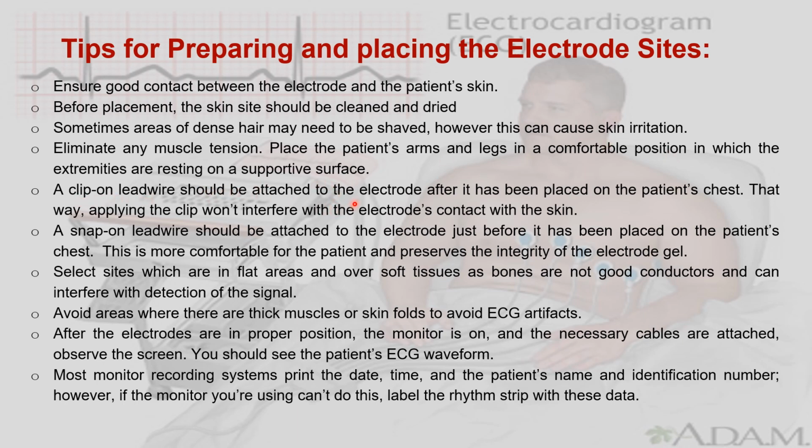The clip on or snap on, it's not a big deal to know the difference between these two. And select the sites which are in flat areas or over soft tissue, because bones are not very good conductors for this electric activity. Avoid skin folds, and after the electrodes are in good position, you turn the monitor on, check the cables, and be sure that everything is okay.